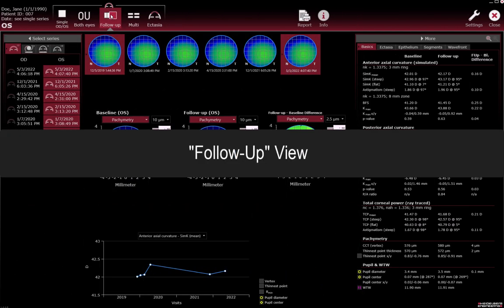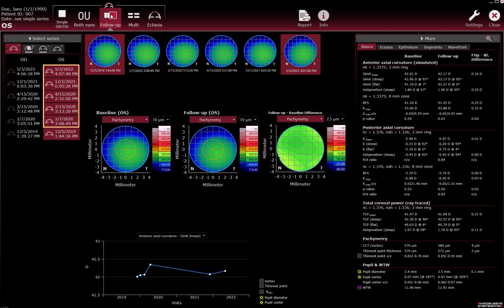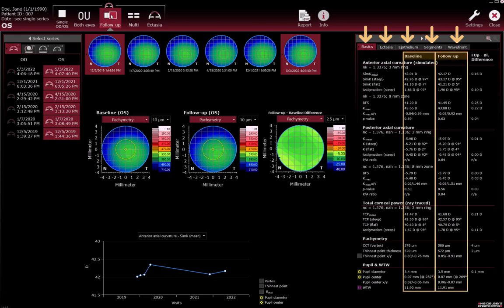Follow-up view. When you switch to the follow-up view from another view and an examination tab was selected, the Select Series section displays up to five of the patient's last examinations that were made on different days, as well as any previously selected older exams. In the More section, the values in all tabs will be displayed for baseline, follow-up, and the follow-up baseline difference.